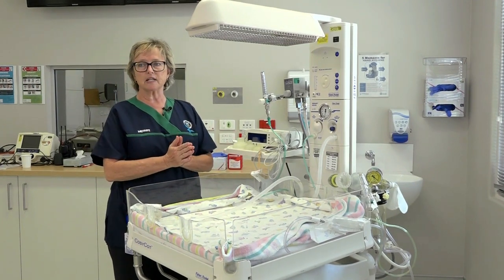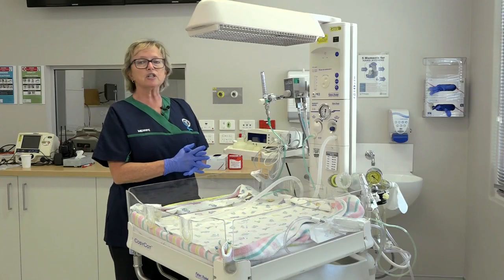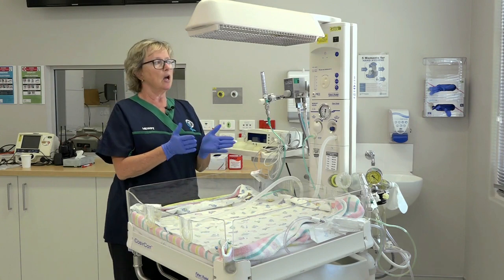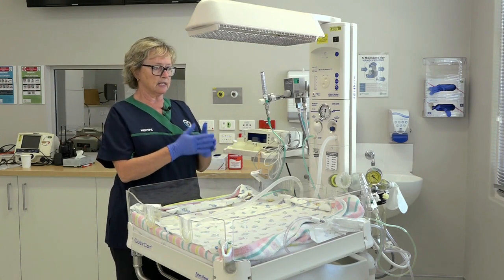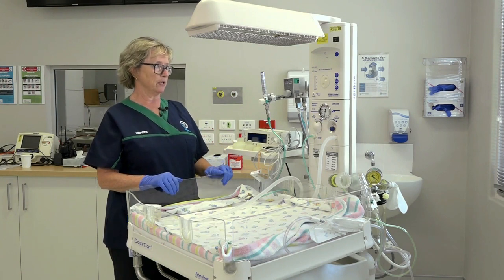Before we commence resuscitation, it is important to start our five moments of hand hygiene. In preparation for the resuscitation, we need to check that everything on the cot is working and is appropriately stocked.